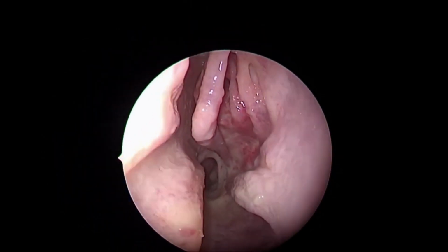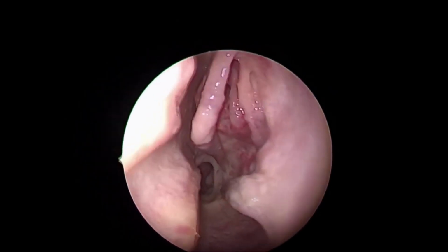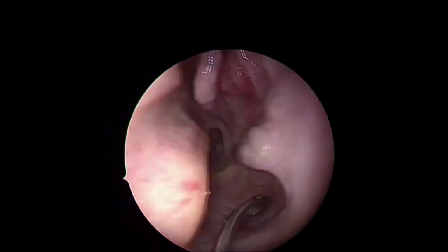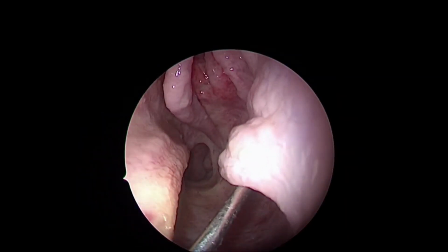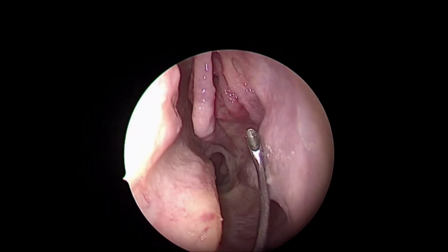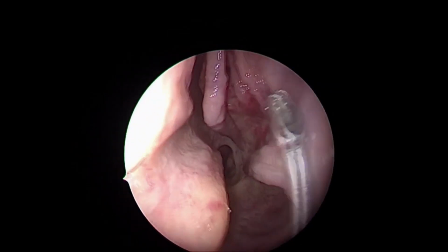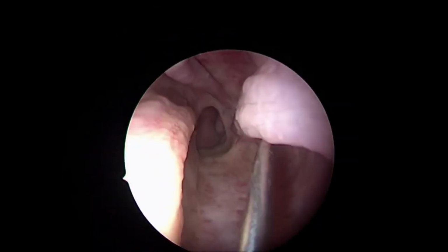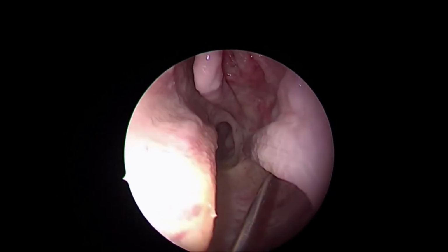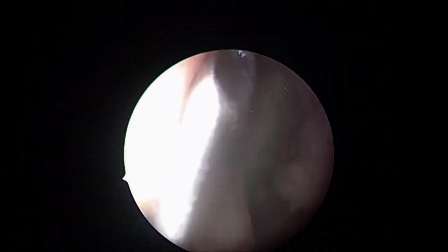But now, as more and more advanced lesions of the paramedian plane are being addressed through the endoscope, a lot of people use it again as another avenue for instrumentation inside the maxillary sinus. But believe me, my message to them today is that once they see the advanced procedures of the maxillary sinus, the inferior meatal antrostomy is no longer beneficial for any indication. Trust me, for me it is as good as obsolete for any purpose.